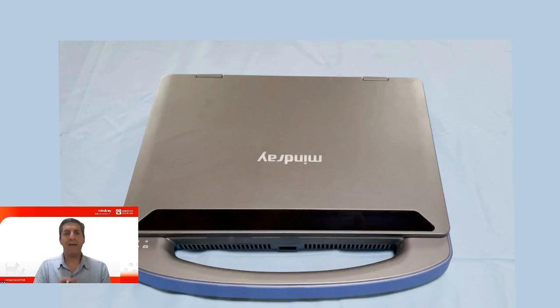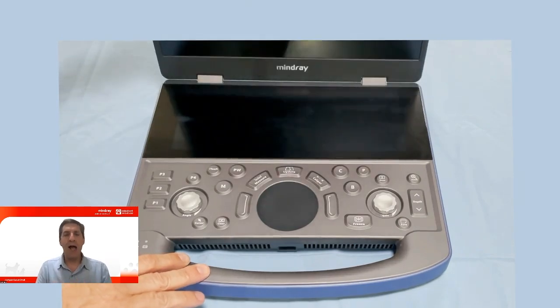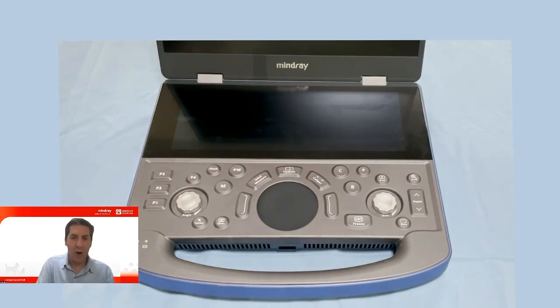And finally, our ultrasound. We need to be aware of how to handle our ultrasound. We need to learn how to use every single button, because this knowledge will help you improve your image.